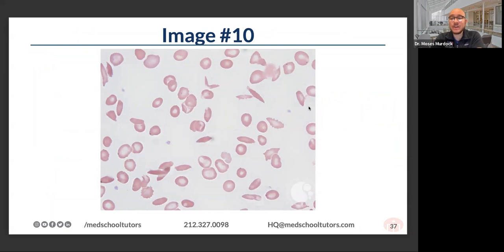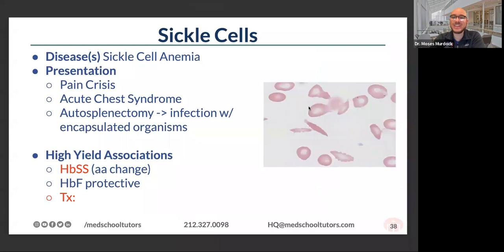Okay, here is a disease with an incredible burden of disease. Folks come to the hospital frequently, and there's recently been a lot of changes, advances in our ability to treat this disease with genetic therapy, or at least that's the promise. And what we're seeing here are like thin, sort of needle-like red blood cells. Folks in the chat, absolutely correct. We are looking at sickle cells and sickle cell anemia.